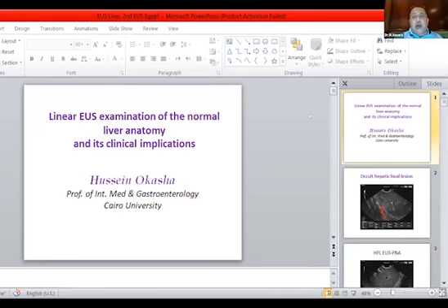It's my pleasure to ask you, Professor Hussein, as regards the problem of seeding. Is there any probability of seeding from the liver if we have FNA or FNB from the liver? Secondly, as regards the technical issue, I think we have to increase the depth, so we have to adjust our machine to 5 megahertz rather than 7.5 megahertz.